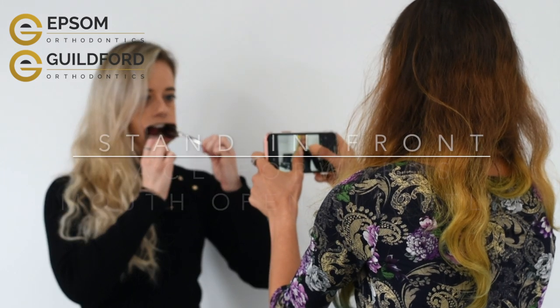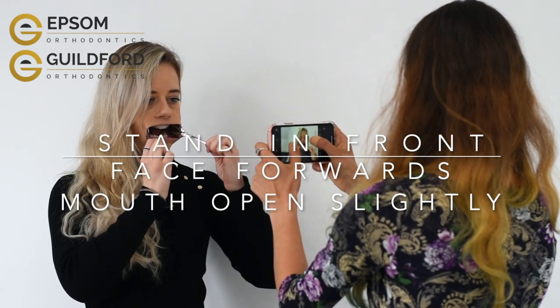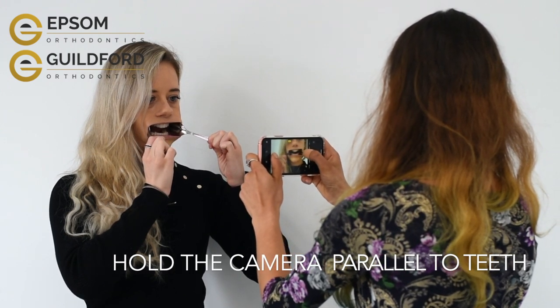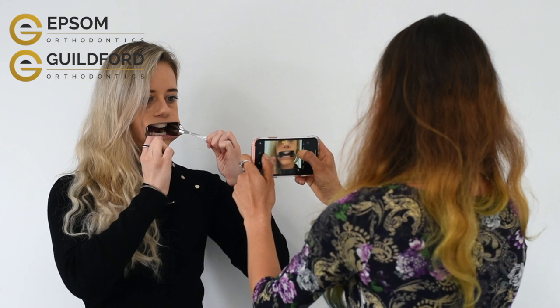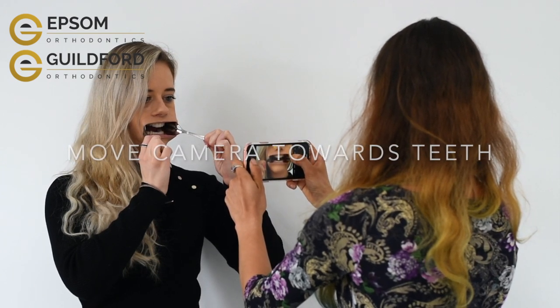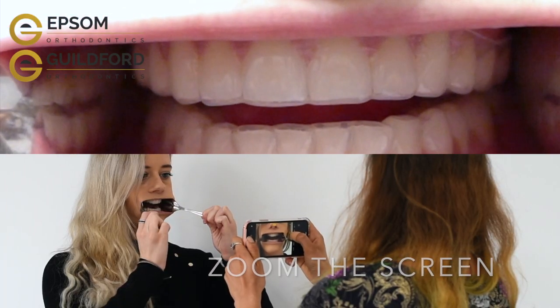Stand directly in front of your helper, keeping your head facing towards them and mouth open slightly. They should position the camera at a parallel level to your teeth. They can then move the camera towards the teeth and zoom in until they see a similar view like shown here.